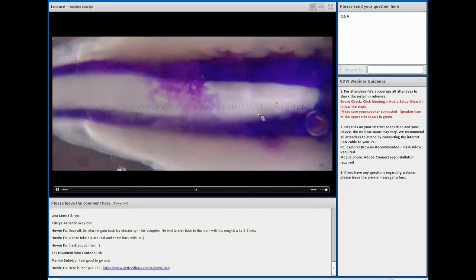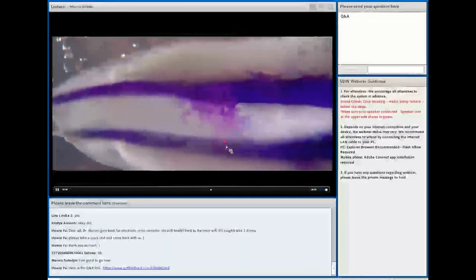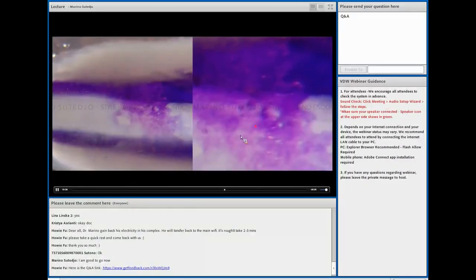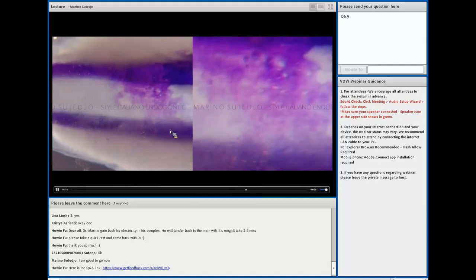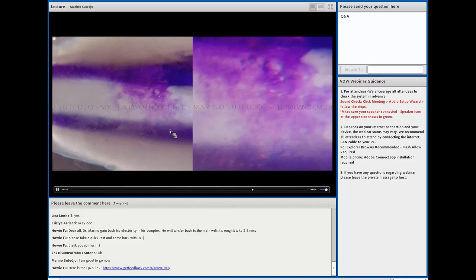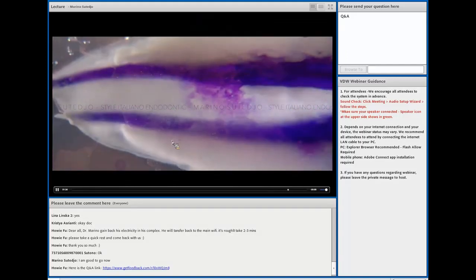Compare that to putting it into this area. But if you put it in both this and this area, as you can see, now I'm putting my ultrasonic in this area. Now on this side, it tries to press laterally and clean the isthmuses better. You can see it now continues to have continuous connections between one canal and the other canals. So this is a system that we definitely need to put attention on when cleaning. Our shaping cannot clean this area. What our shaping can do is create the volume so our irrigants can go into the length, and we can do some activation to drive our irrigants into the areas that cannot be penetrated with a normal irrigation protocol.